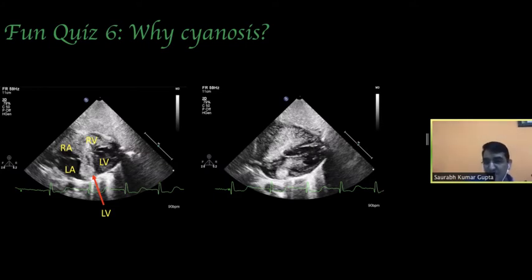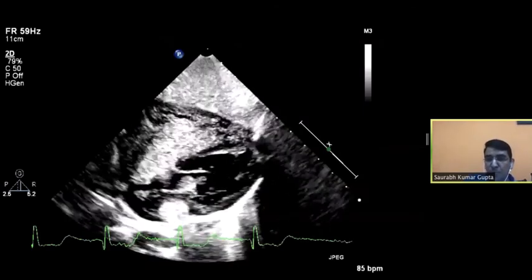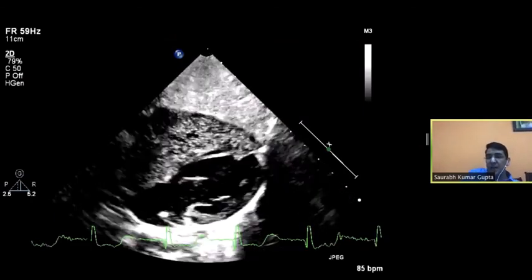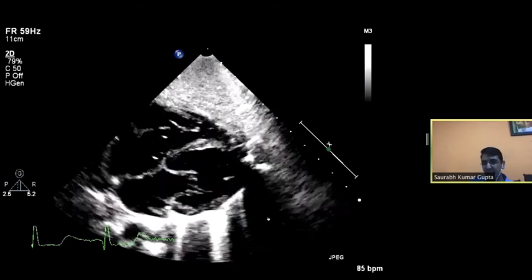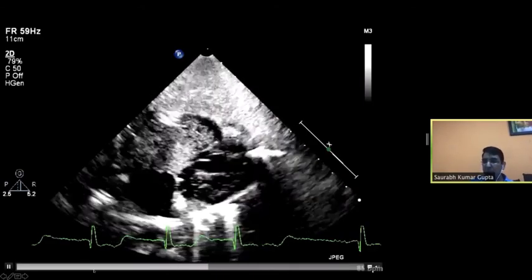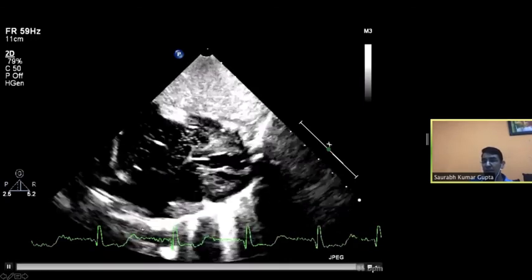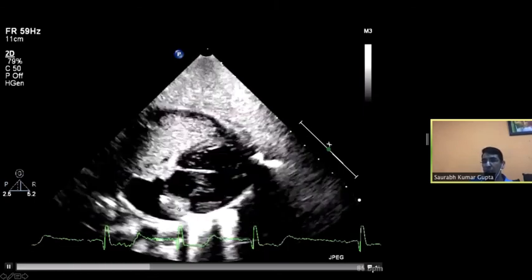I'll not be able to listen to your answers, so you may write in your chat box, but I'll just tell what we did then. So we performed saline contrast echocardiography from the left arm, and as you would see, something is appearing in the left ventricle. Now, just like angiocardiograms, if you see the saline contrast echocardiography as it is, as you have acquired, it becomes quite difficult.